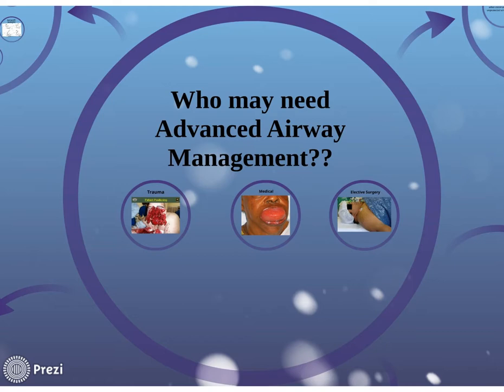But if you go back and look at Dr. Cushenberry's pictures, there's every variety you could possibly see of things that you're going to have to think about. Okay, what's that? Yep, people go, I've never seen it. Thank God, you hope you never do. And somebody else once said, well, let's just do a nasal intubation. Okay, where does it go? Down. Yeah, it takes that turn, right? It takes that turn. So you're eventually going to run into this.